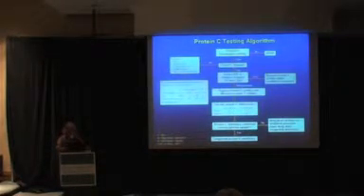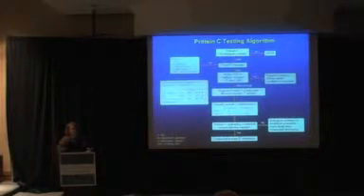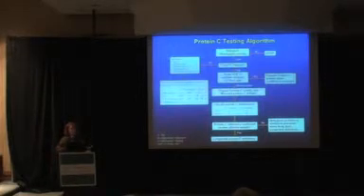So let's look at an algorithm for protein C testing. Let's say with protein C, again, you start with a functional assay like a chromogenic or a clot-based assay. If that's normal, you stop. If it's low, then you have to start looking at some of the other lab parameters. Are the patient's PT and PTT normal? Well, if they're not normal, then you want to think about looking at their liver function tests, or their fibrinogen level, or look up the medical record and see, is this patient on warfarin?